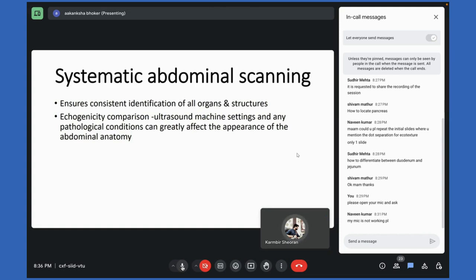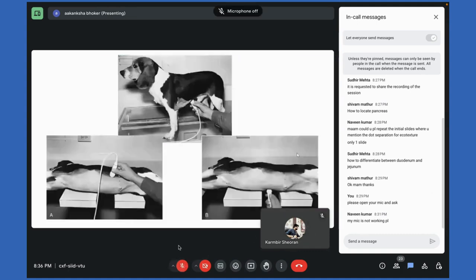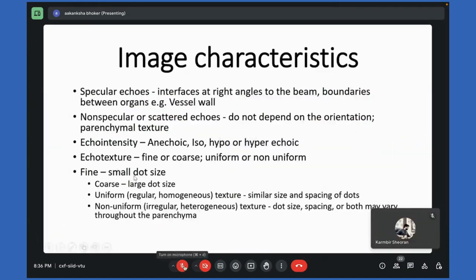Ma'am, one question from Naveen Kumar. Could you please repeat the initial slide where you mention the dot separation for ecotexture? Yeah, sure. This one? Yes, ma'am. See, when the dots are very small, then it will be a fine ecotexture. Example is spleen. When the dots are of large size, then it will be coarse, like a liver. Then uniform and non-uniform: if the spacing is almost consistent, small-size dots which are very consistent, then it is uniform, regular. Non-uniform means the spacing is disturbed. This non-uniform ecotexture can happen during some pathologies. I will show you the slides in the next class where you will see examples of non-uniform ecotexture.